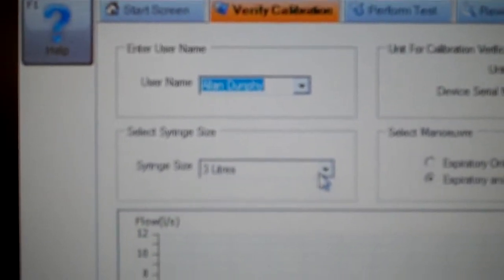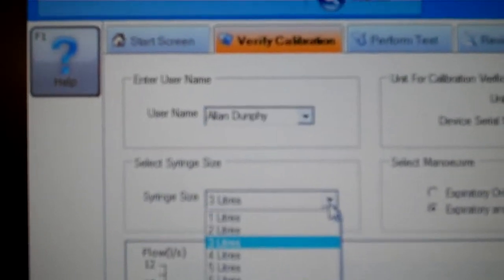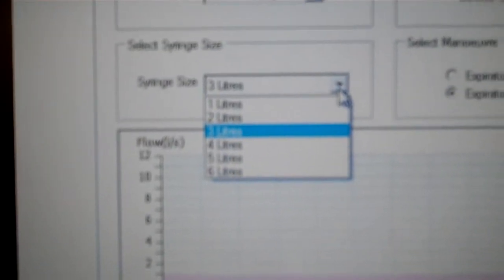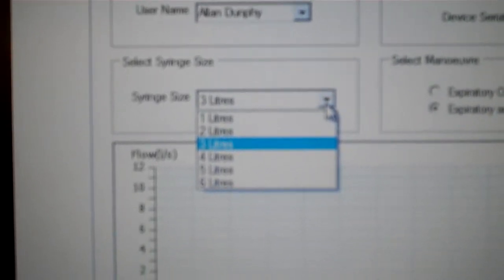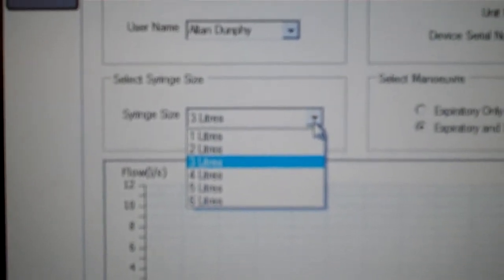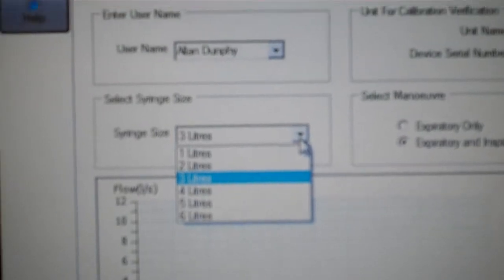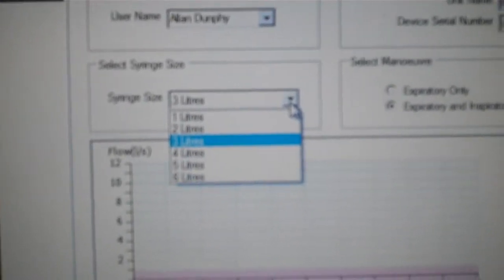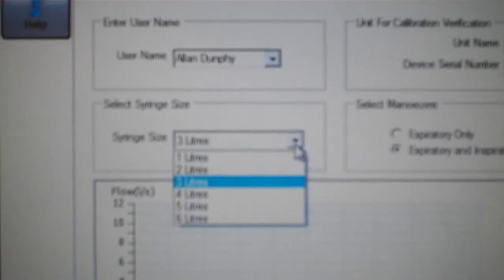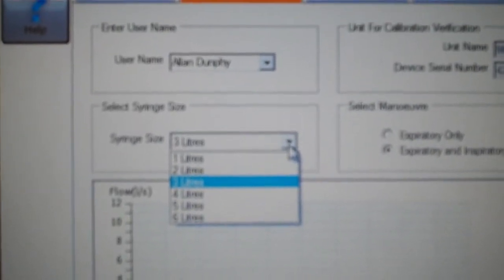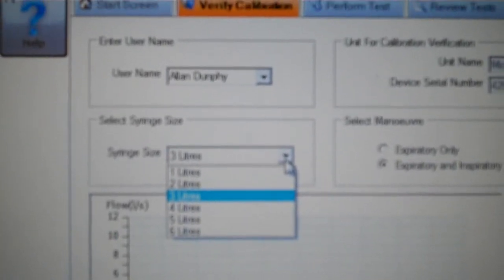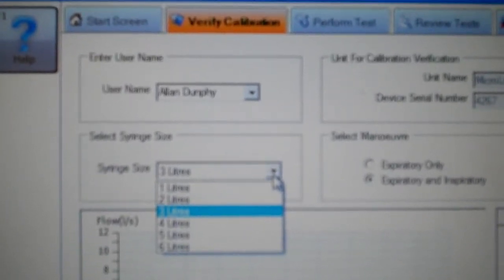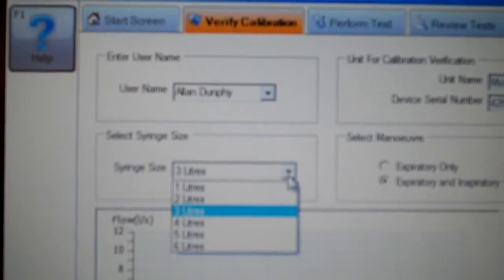I am using a 3-liter syringe. We are using the 3-liter syringe, but there are other types of syringes that are available. Whatever your lab is using, that is what you would put in there so that we are using an accurate volume. We just have to make sure that it is a medically sound and approved calibration syringe for doing these procedures.